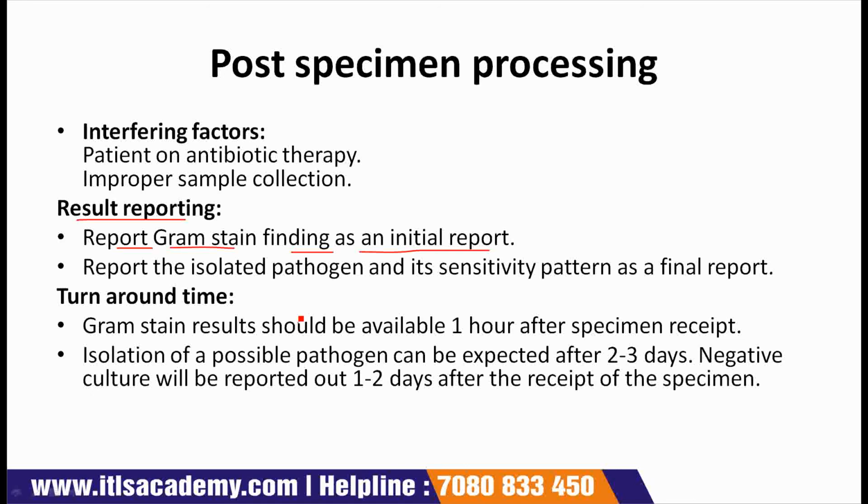Once you have produced a sputum sample for analyzing, it should be taken to the laboratory within 1 or 2 hours of coughing it up. The laboratory will place the sample on a special plate that has a nutrient that helps bacteria or other pathogens present in your sputum to grow.